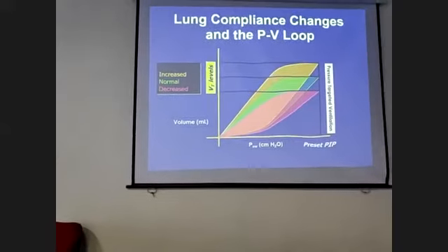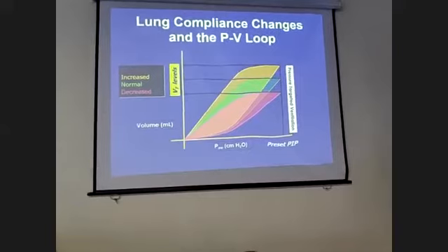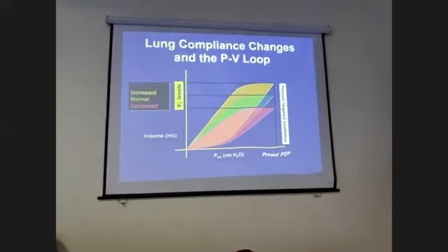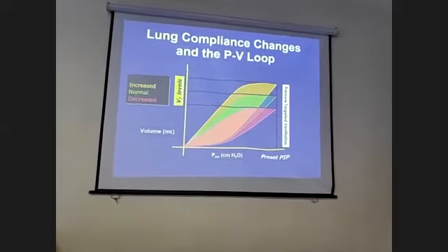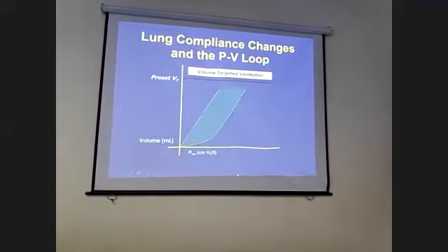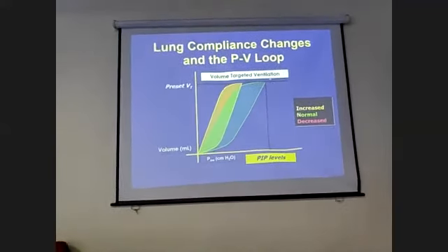So this is the importance of mechanics when you try to understand mechanics through graphics. So I am trying to make you understand mechanics. Just now I have shown how the compliance changes when the pressure is fixed. Now I will show you another graph. What we are doing is that we are fixing the volume. In the last graph, we fixed the pressure. Here, we are fixing the volume.